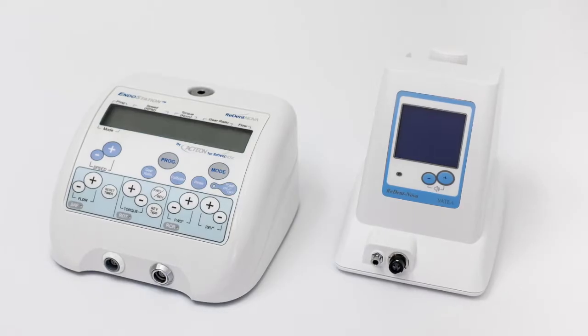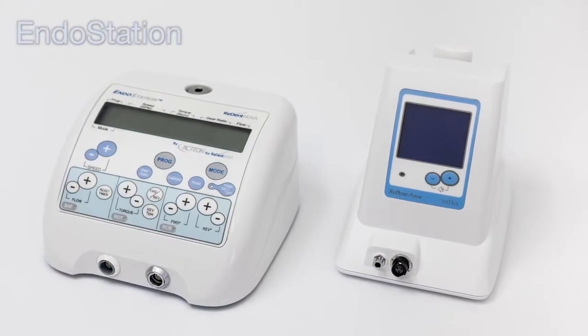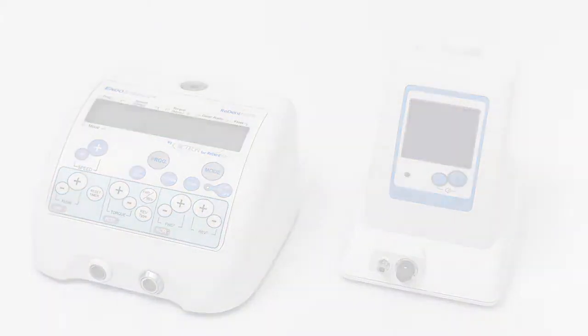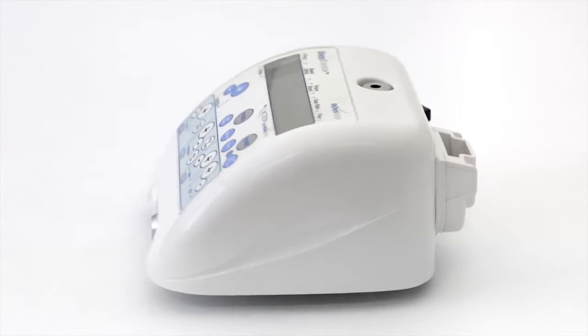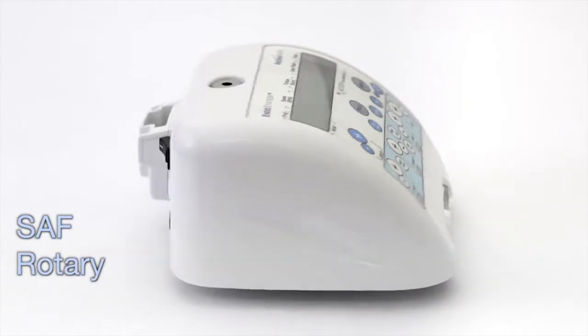There are two options for operating the SAF system. The first one is by the all-in-one endo station, and the second one is by the Vitea irrigation pump system together with an existing endodontic motor. The endo station is an advanced endodontic motor that enables working with all leading motor-driven endodontic file systems, including SAF, rotary, and reciprocating.